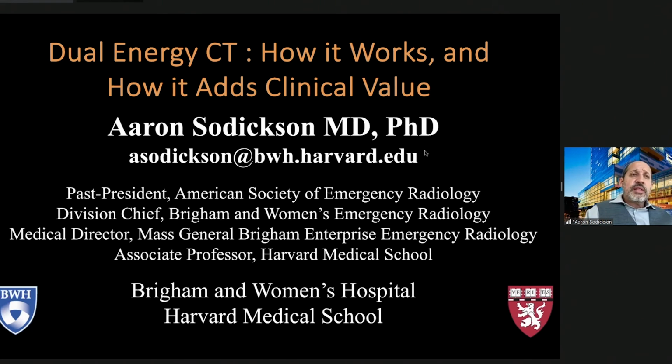My answer is that IMAR and the other MAR algorithms, well, let me back up. The way those metal artifact reduction tools work is they basically try to find photon-starved projections next to a hip prosthesis and interpolate the projection data with adjacent projections that are not photon-starved. So it does a great job, in my opinion, of getting rid of streak artifact, but it does introduce some additional artifact and kind of fuzzy distortion around the areas of metal.